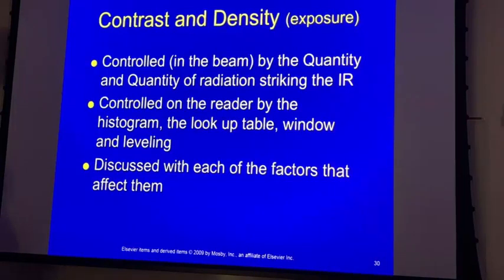But the best explanation we have is still what we understand or think we understand about photoelectric interaction inside of the patient, transmission of scatter radiation, right? All of that has been unchanged regardless of what image receptor speeds and detection and dynamic range is done. We still have to have that differential absorption inside of the patient.